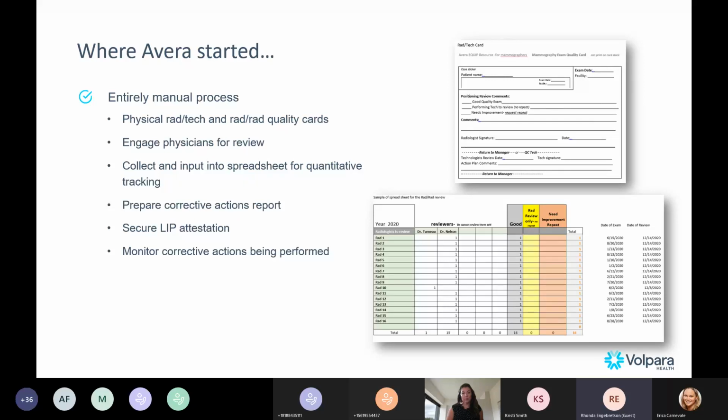I have 2 lead QC techs that were doing monthly QA on the technologists. They were randomly picking a case, and then doing a peer review on it. And that was just for our 18 technologists here. Because we rotate through so many different areas, it was quite a process for them to identify all of the sites that we rotate through, try to find an exam, and then basically critique the exam themselves.